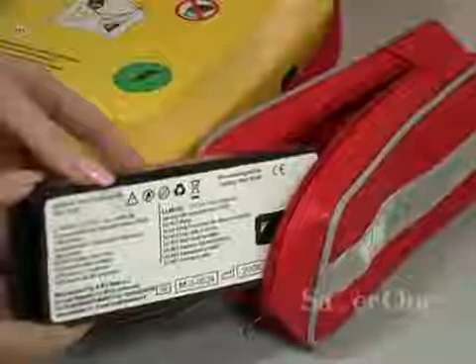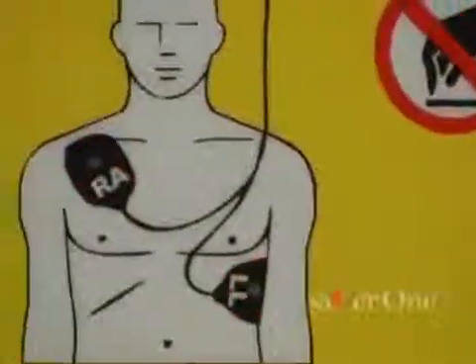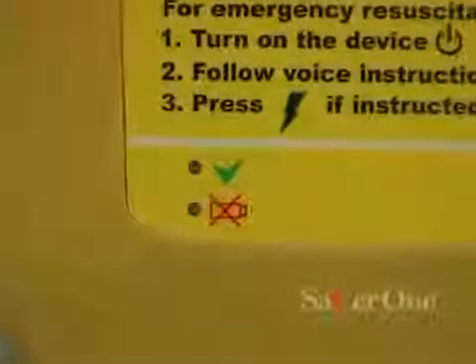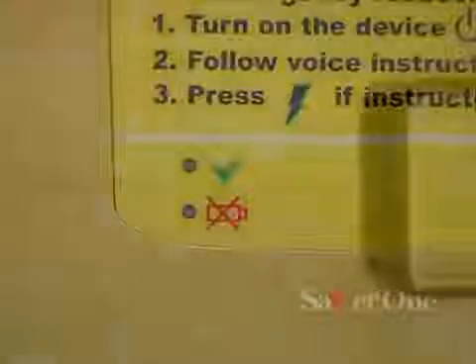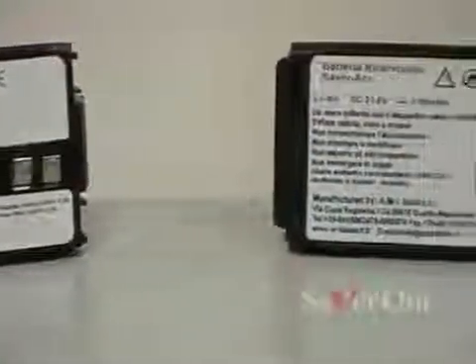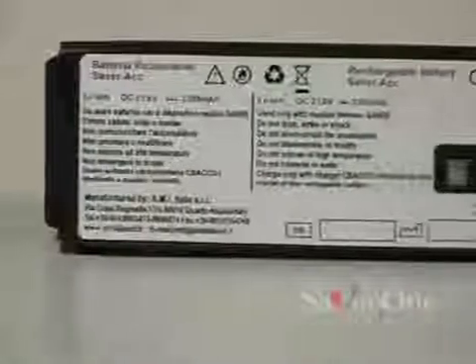Spare batteries can be stored in the side pockets. The Saver One uses batteries the operator can easily and quickly change. Two different kinds of batteries can be used: disposable batteries, lasting three years from installation date in standby mode, and rechargeable batteries, which can be recharged using the suitable dedicated charger.